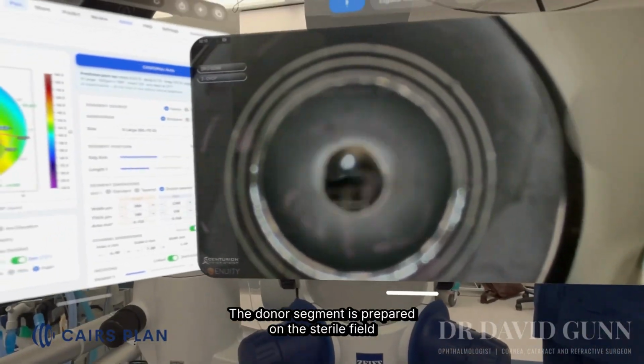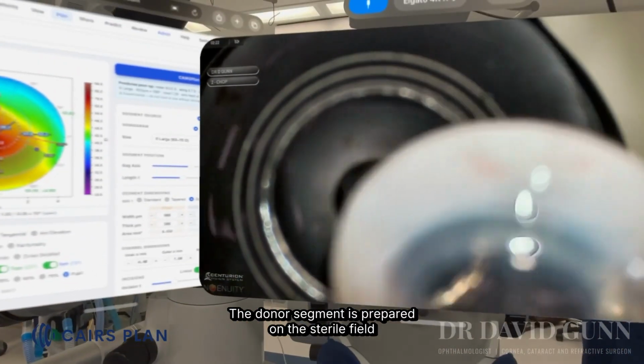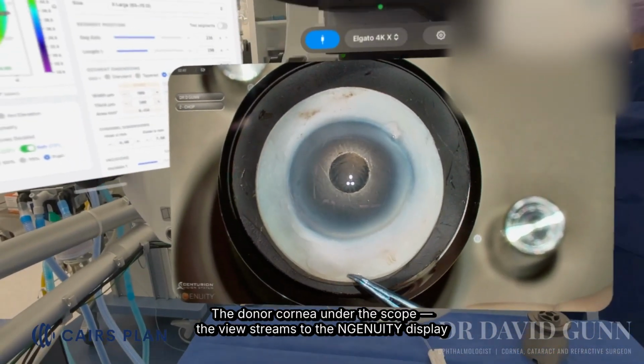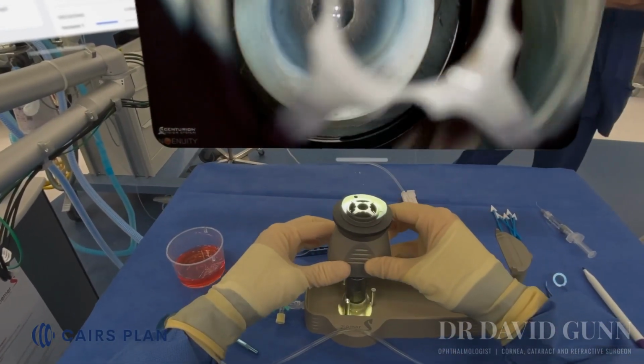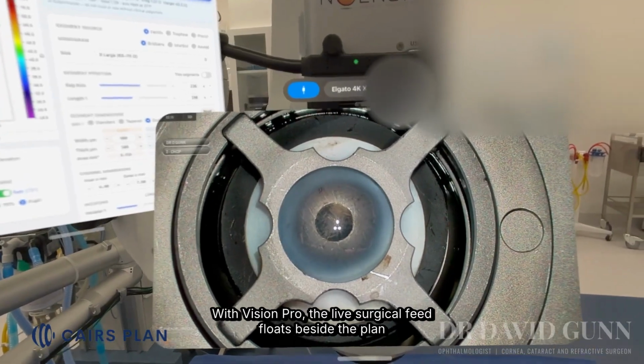The donor segment is prepared on the sterile field. The donor cornea under the scope. The view streams to the Ingenuity display. With Vision Pro, the live surgical feed floats beside the plan.